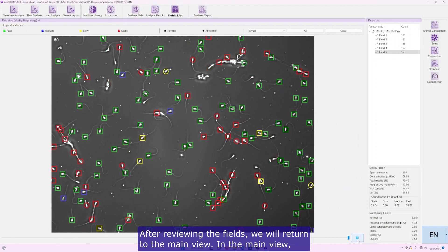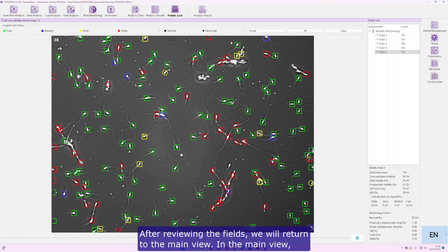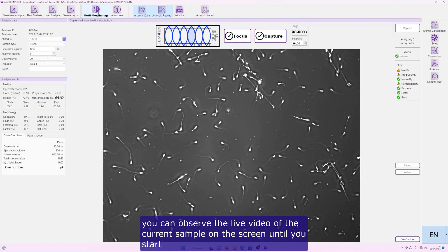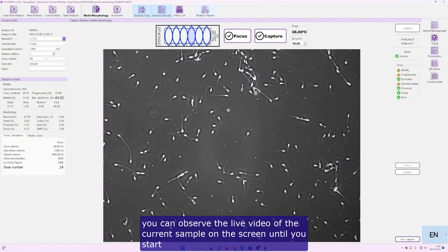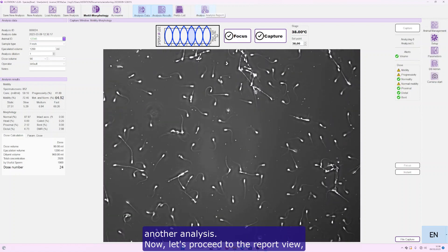After reviewing the fields, we will return to the main view. In the main view, you can observe the live video of the current sample on the screen until you start another analysis.